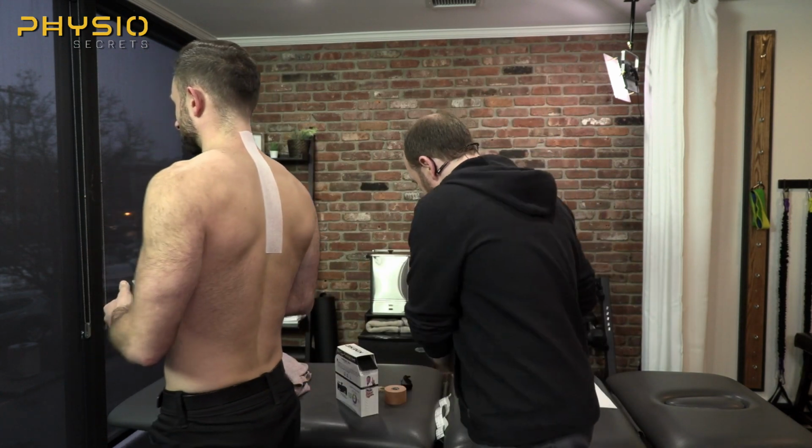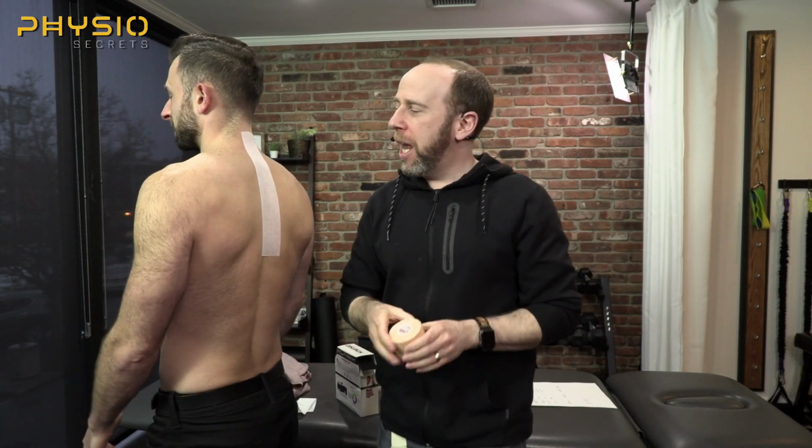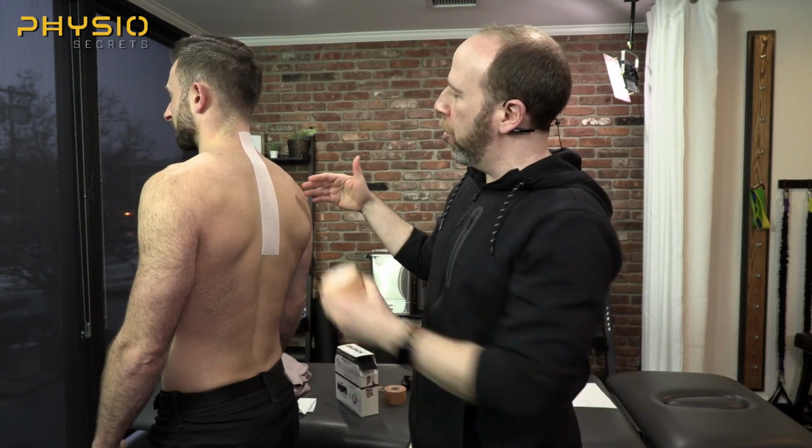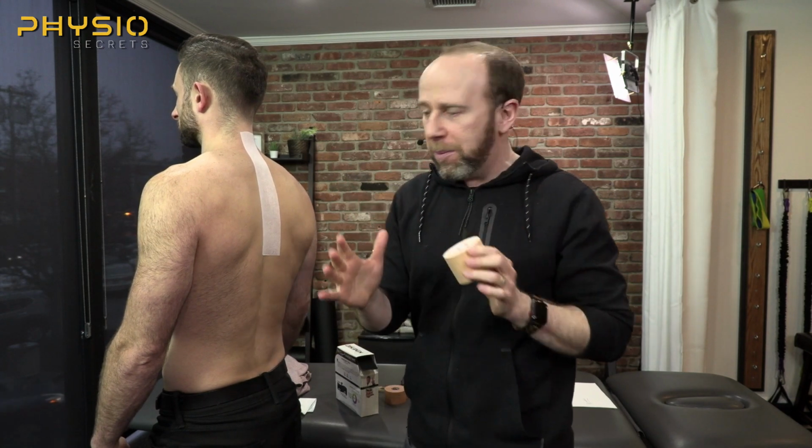And we're going to do one more tape application, and we're going to use something called dynamic tape. And we're going to use dynamic tape to give you some periscapular retraction. Now, I just want you guys to see the difference in the tapes by doing this.